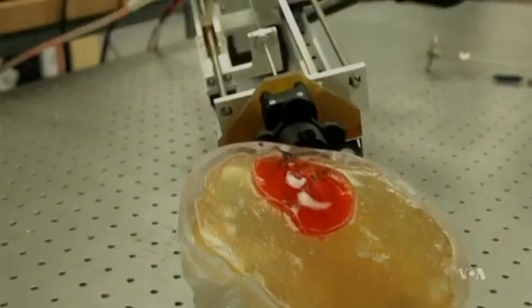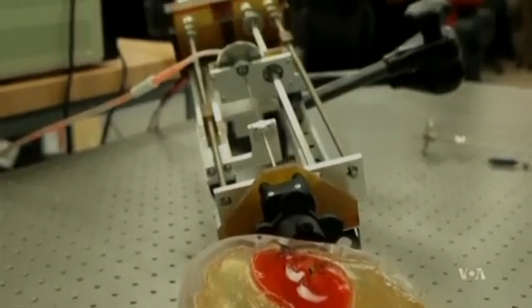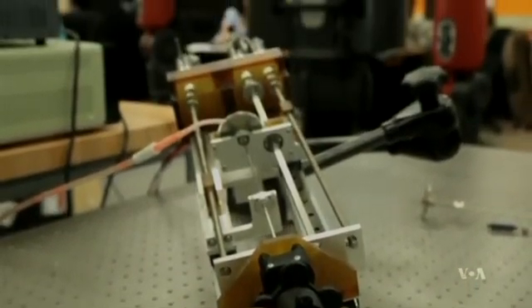If surgery using this robot and the needle attachment works, it could save many lives.